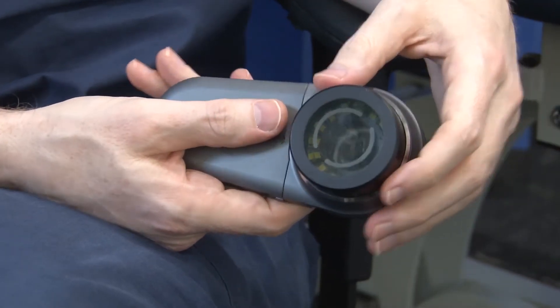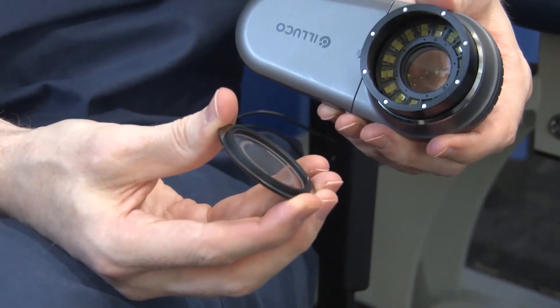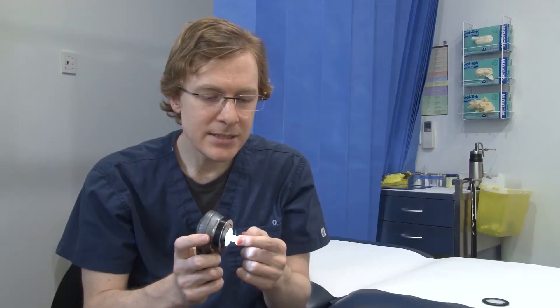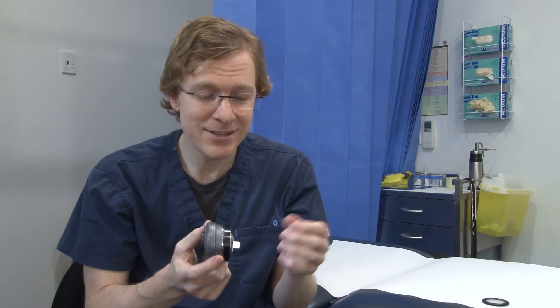When I looked at Anna's ear spot, I actually took off this faceplate and grabbed this little gadget — this adapter — for just looking in little hollow areas, like concha bowls, belly buttons, for example. I saw a belly button melanoma on a 28-year-old a couple of years ago. That was a bit of a surprise.